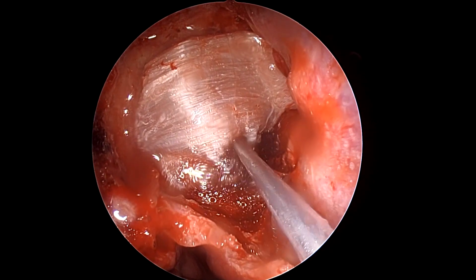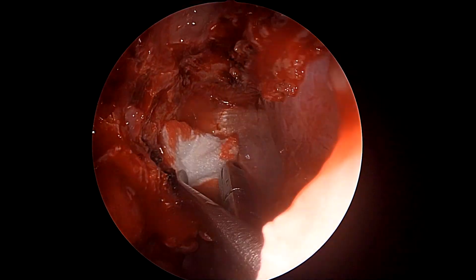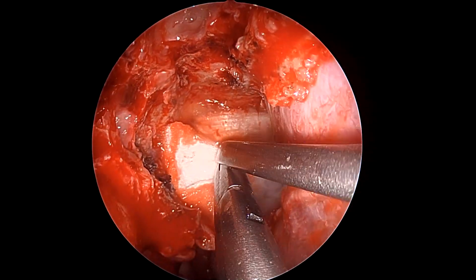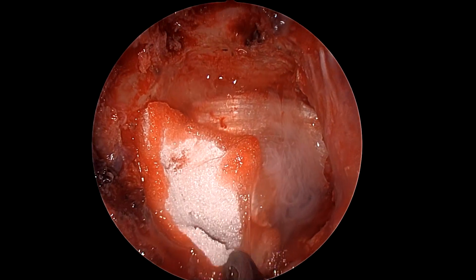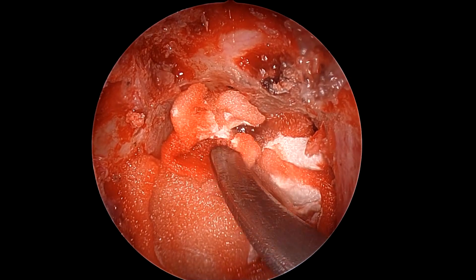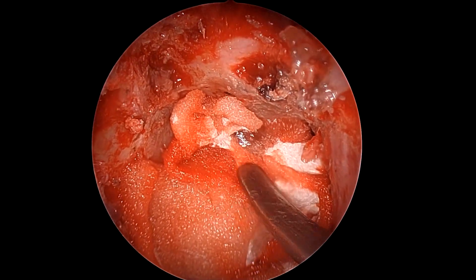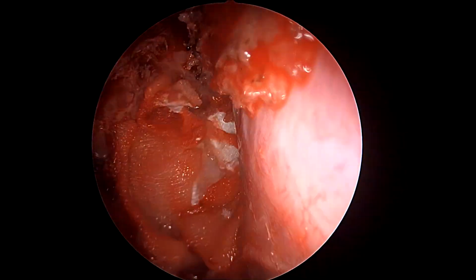A little tissue glue can be placed over the fascia, followed by Gelfoam patties, just like we do in tympanoplasty and mastoids. To completely set this off, we use crumbled Gelfoam, and then we again straighten them off, to make sure that this fascia rests nicely.